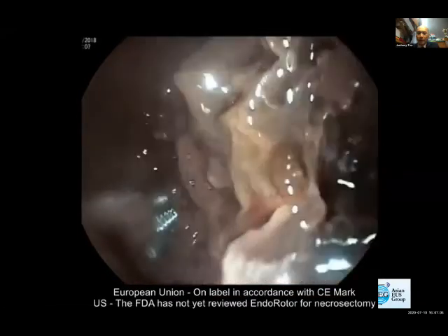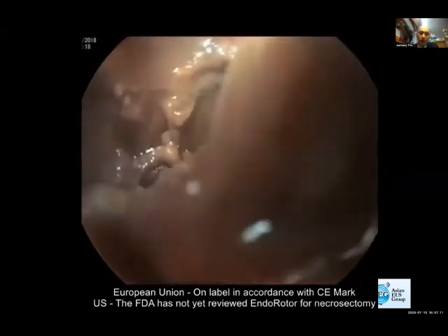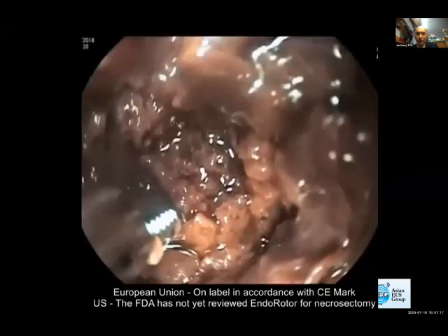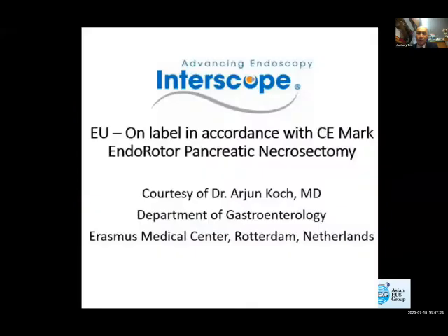I've seen a few cases. It seems to be quite effective. Of course, you need to be careful not to suck in any vessels or anything like that. But for those who have done necrosectomy, you know that sometimes the procedure can be very cumbersome. So it seems like the device works very well in these sorts of cases.